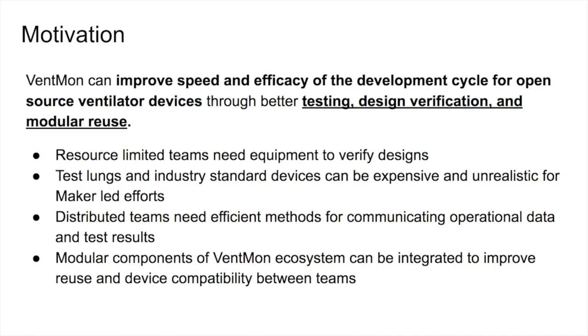Secondly, we wanted to create a better platform for teams to share information and test results between themselves. In a lockdown situation, it's really hard for people to communicate in person. So it seemed incredibly important that we provide a platform which would allow the same type of communal development to happen in a remote way.